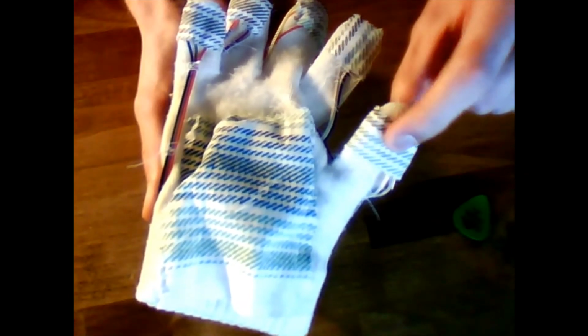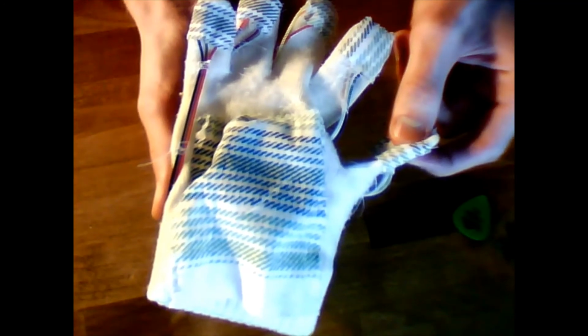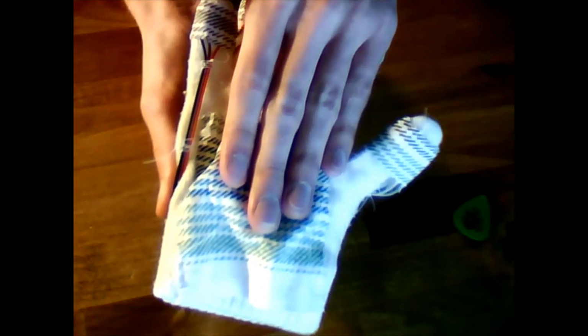Let's take a closer look. As previously stated, this prototype uses Hall effect sensors. Underneath each of these sewn tabs on the finger is a Hall effect sensor. As you can see, the thumb contains 2 Hall effect sensors to measure 2 directions of motion. Underneath this center fabric is our magnetic source. As our sensors move closer to the magnetic source, they experience a field with a greater strength. This will change our output to indicate the distance from our finger to our palm.